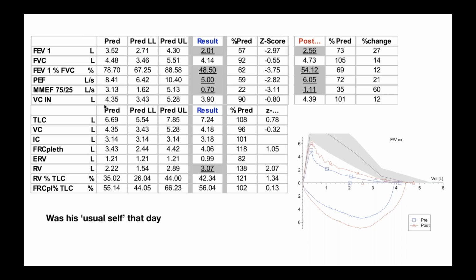And we all got a bit of a surprise. I guess maybe me, I'm not so surprised these days because I've seen this many times before. He has quite significant airflow obstruction on spirometry. You can see his FEV1 to FVC ratio is 0.49. His FEV1 is 57% of predicted. You can see the very large bronchodilator response, but he has persisting airflow obstruction.